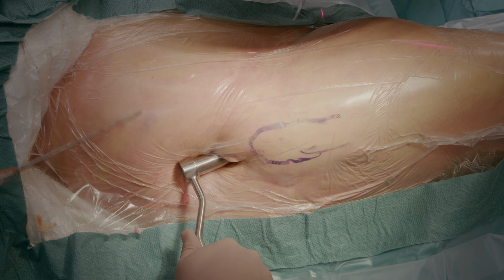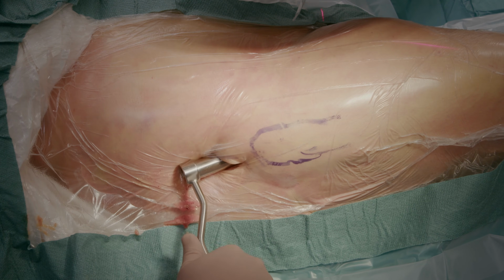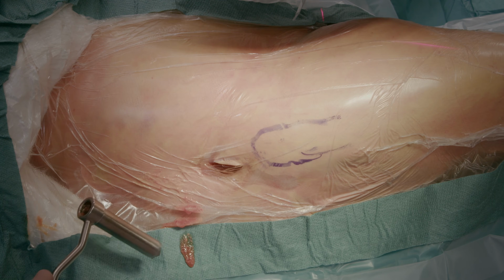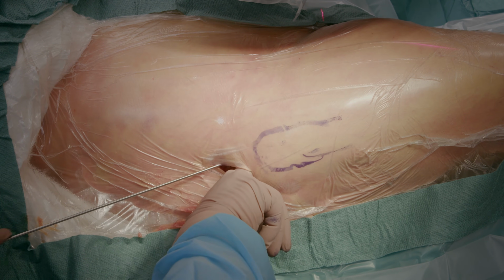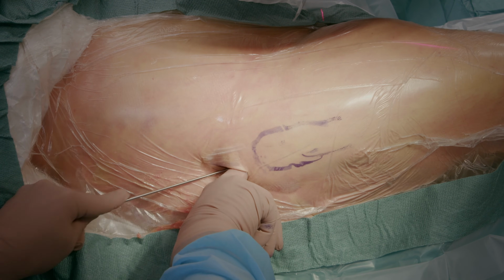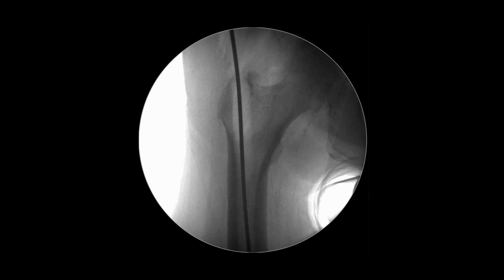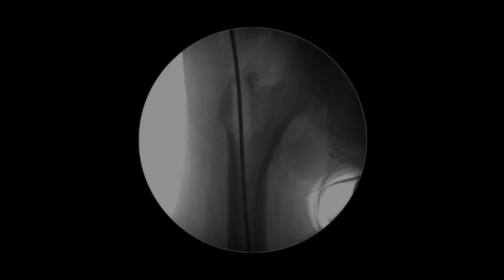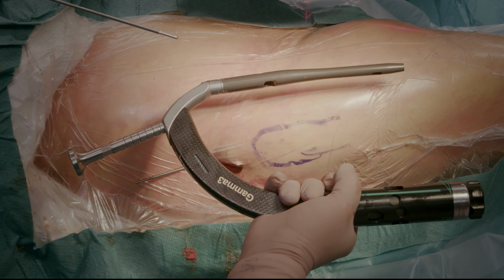When the reamer is pulled out, the guide wire often comes out with it. The wire should be placed back before inserting the nail. Now you can palpate the greater trochanter and check by fluoroscopy that the wire is still correctly positioned. Now that the guide wire is in place, we start inserting the nail.